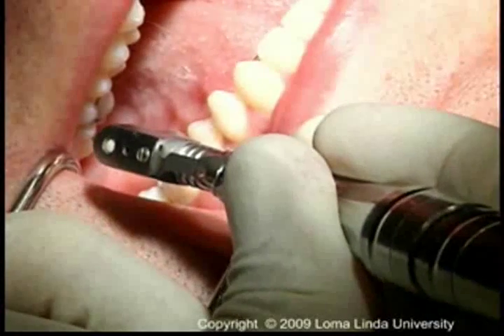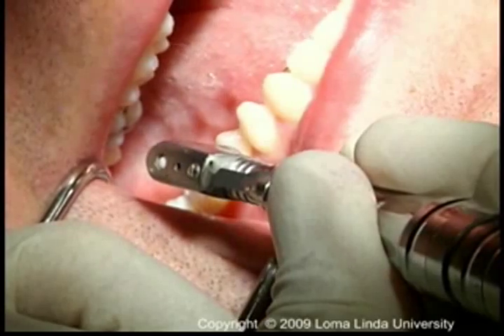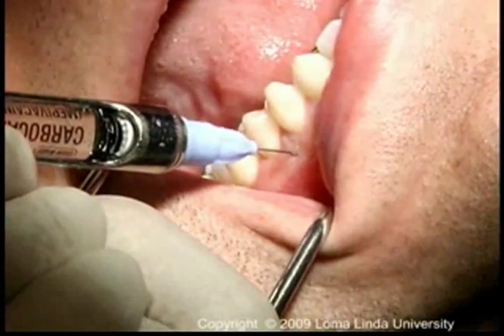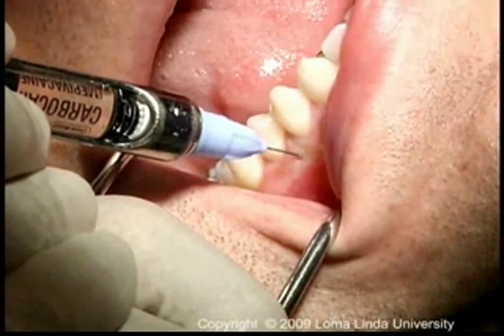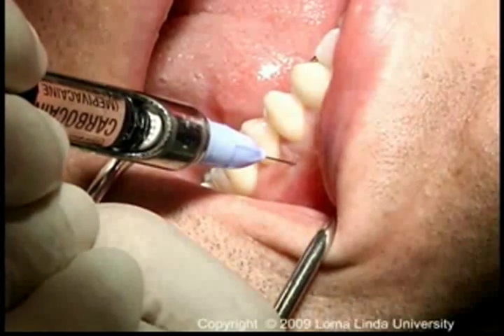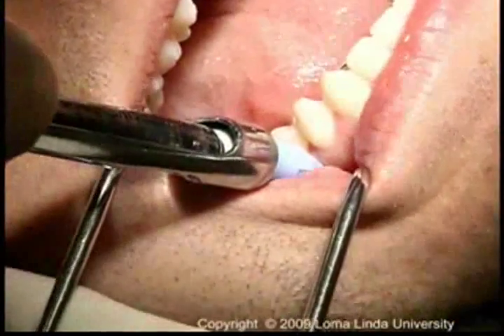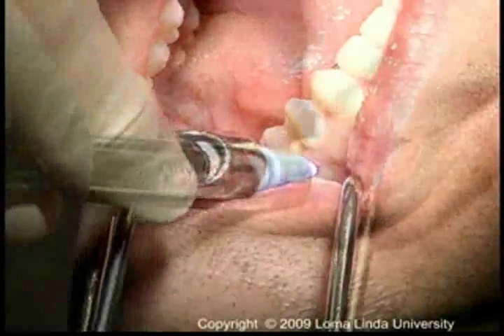The perforator has been replaced, and this alternate pressure is continued until the perforator drops through the cortical plate and into the medullary bone. The needle must be positioned exactly in the same spot and in the same orientation as the perforator. Otherwise, it will not penetrate and be in proper position. Some maneuvering is often required. Place the needle to its hub against the tissues to minimize leakage of anesthetic into the oral cavity.